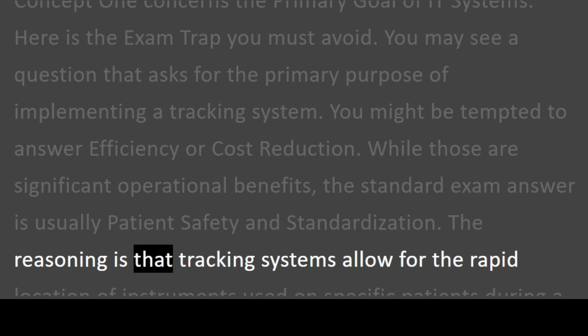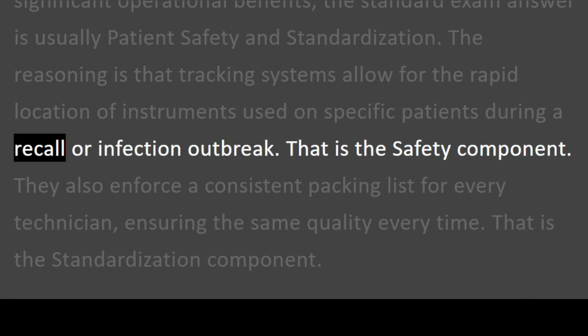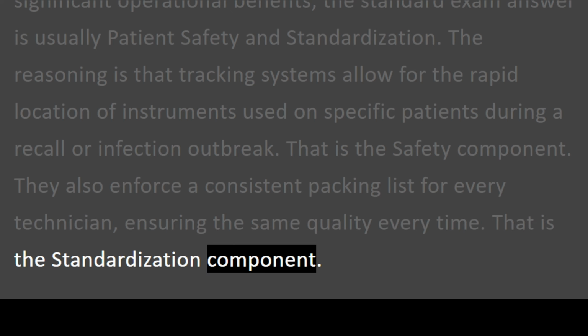The reasoning is that tracking systems allow for the rapid location of instruments used on specific patients during a recall or infection outbreak. That is the safety component. They also enforce a consistent packing list for every technician, ensuring the same quality every time. That is the standardization component.